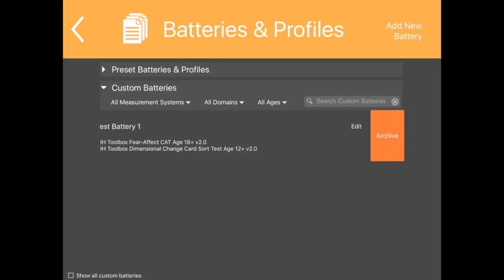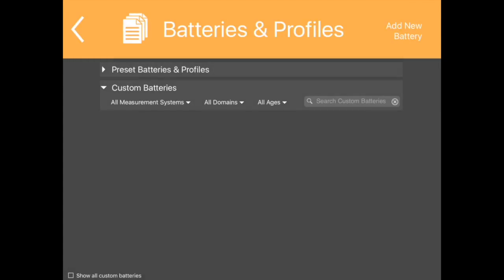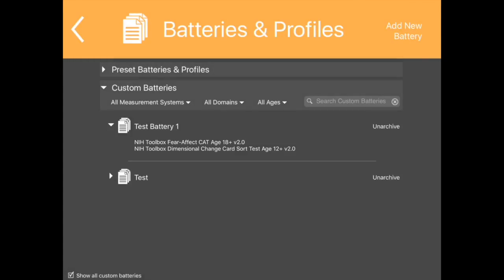To archive a battery, swipe the desired battery to the left. The orange Archive button will appear. Select Archive. To unarchive a battery, select Show All Custom Batteries in the lower left corner of the screen. Archived batteries will appear.